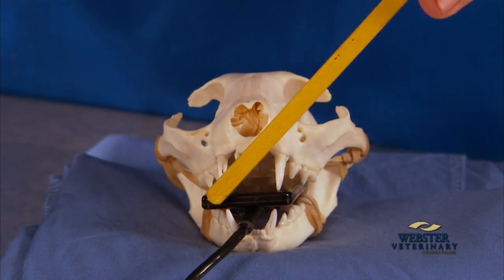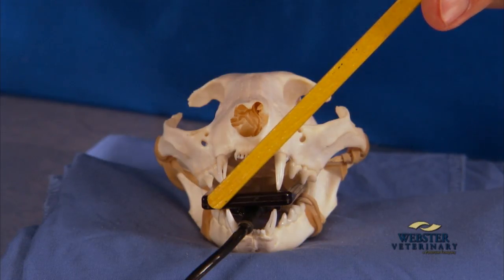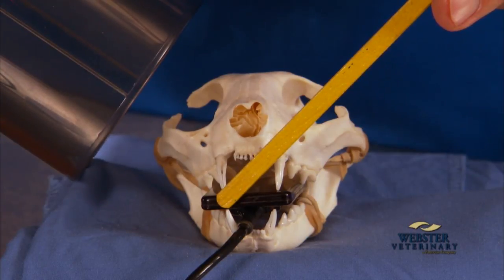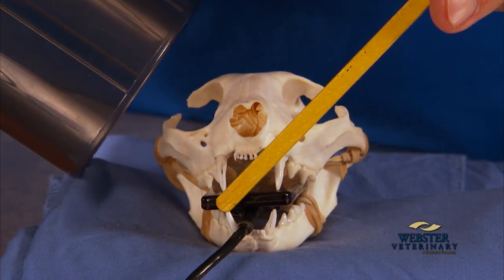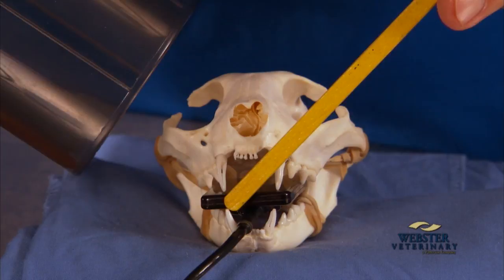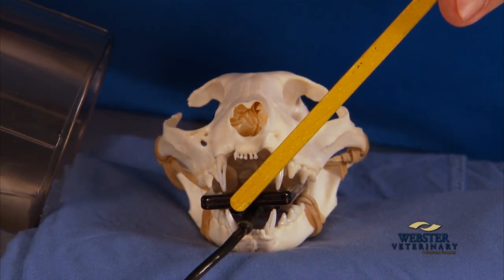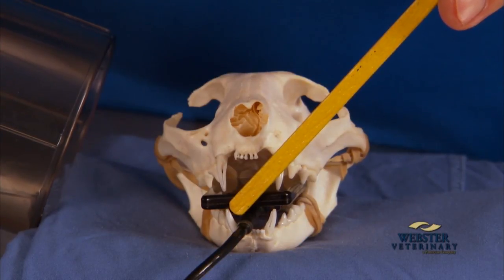Therefore, the resulting bisecting angle is this plane, and the cone head is moved into the bisecting angle positioning. In order to prevent superimposition of those roots in the zygomatic arch, the cone head is rotated downward in order to elongate those teeth slightly and get an acceptable image.